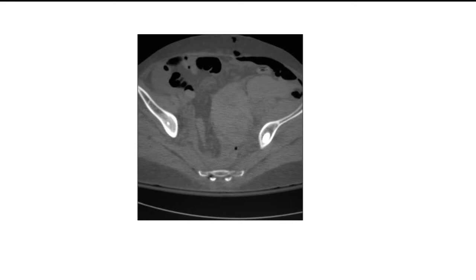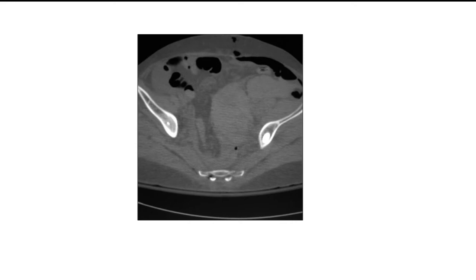In this video you can see the trajectory — it goes through the SI joint and then stays in the iliac crest all the way through.